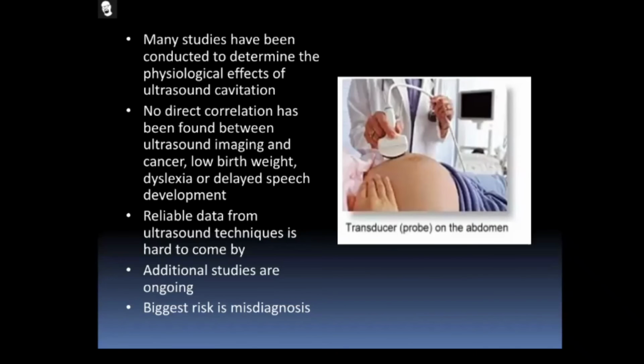Many studies have been conducted to determine the physiological effects of ultrasound cavitation. I already told you, this ultrasound was invented in 1940, especially for therapeutic purposes. Through the sound waves, the hope was to break down tumors. That is what this ultrasound machine was actually invented for. But later on, the doctors predicted that we can't break tumors using these sound waves. Then the ultrasound machine was used for diagnosis.